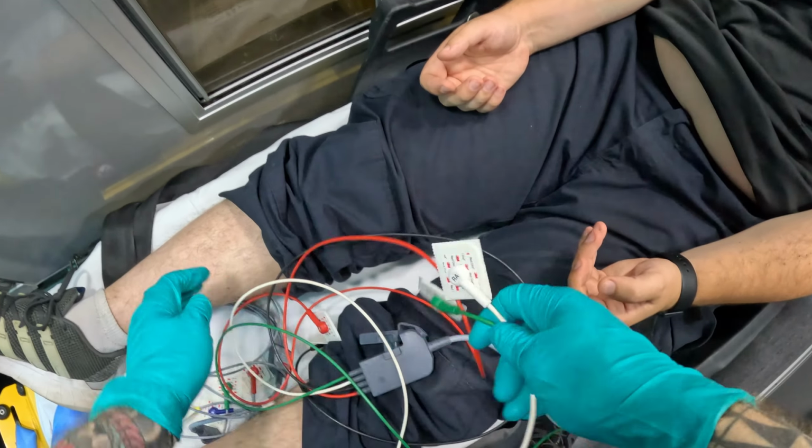Then I feel the third intercostal space, right here. Let me make sure you guys see that. And then I go one over. This is the fourth intercostal space. Take one of your fingers and put it right here. So this here is the fourth intercostal space, and here is where the first one, V1, is going to go.